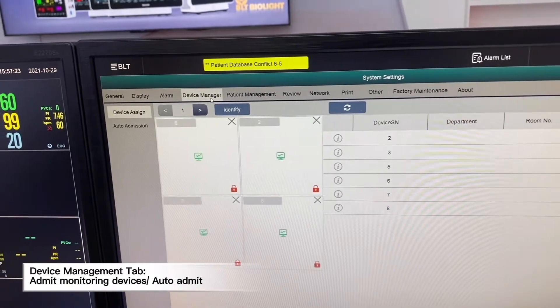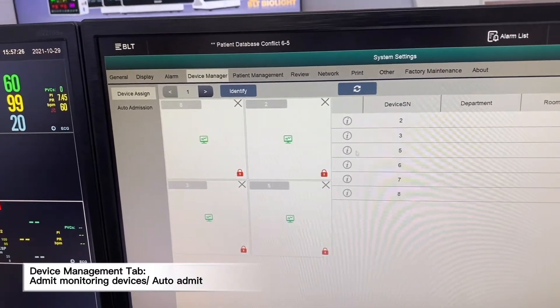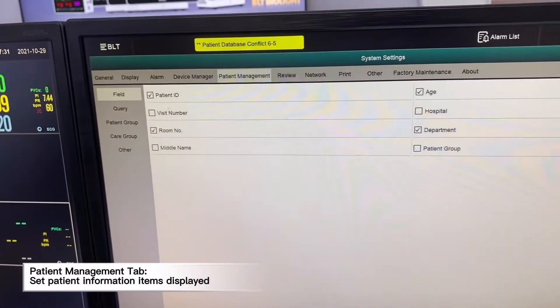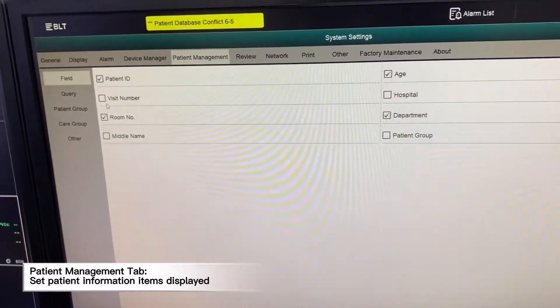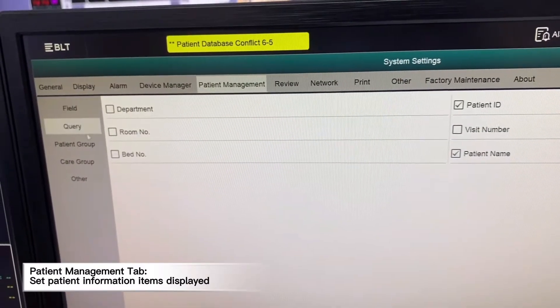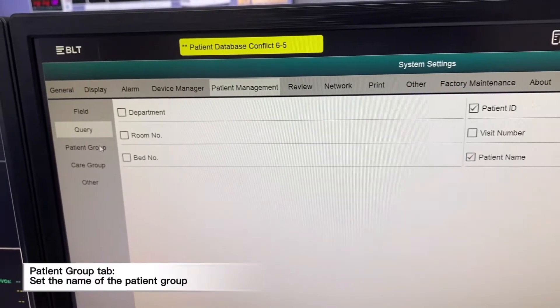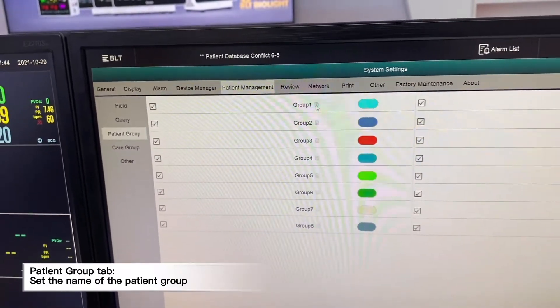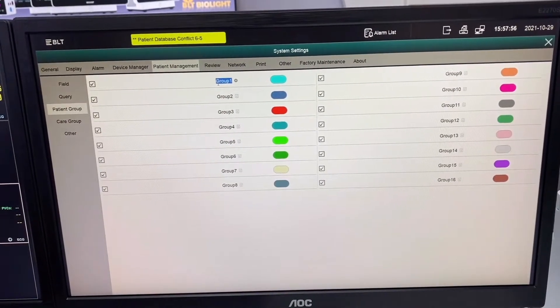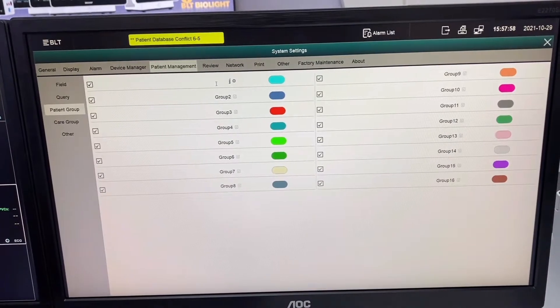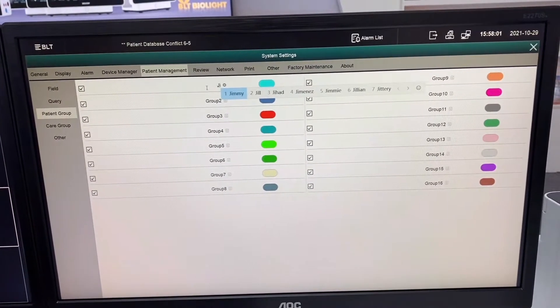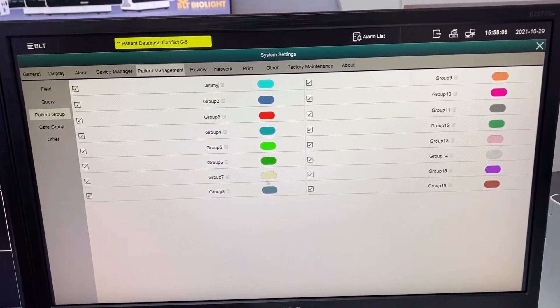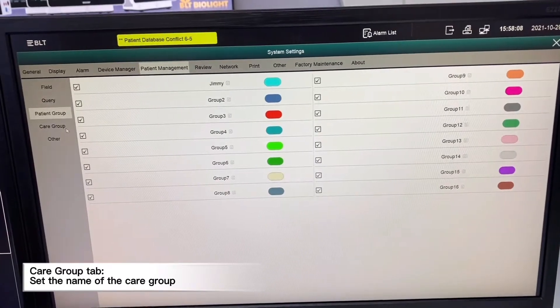We can change device management depending on the sequence that you want to arrange. When we go to patient management, we can choose the information that we want, change the patient group depending on the necessary needs, and change the group name and patient group name.